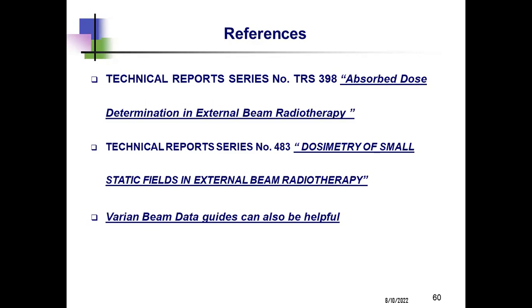So that's why I mentioned in a slide that we need to cross check if somebody is new like us, that your symmetry should be considered at the shallow depths and the deeper depths. If it is not coinciding in the beginning, it means you must first check your setup, then your machine. So it will save your extra labor. Yeah, that's true. That's true.